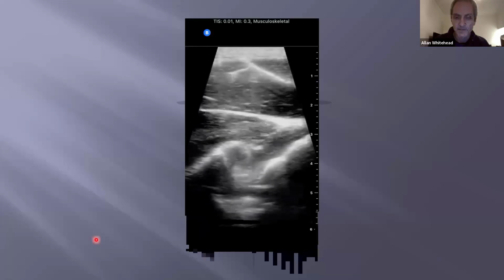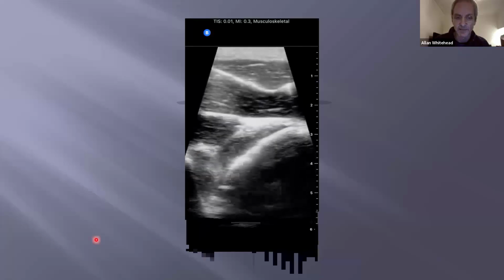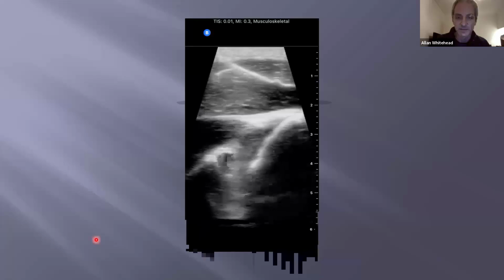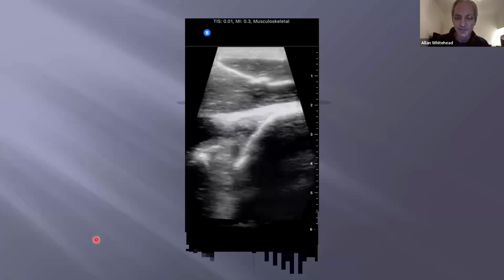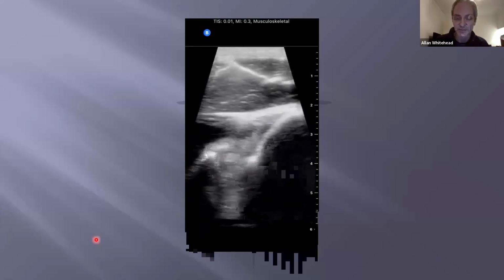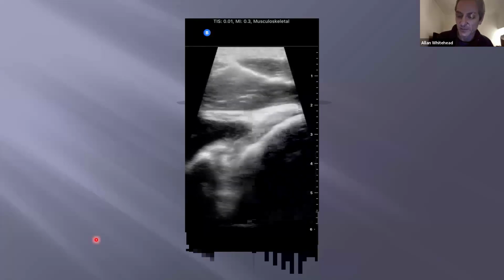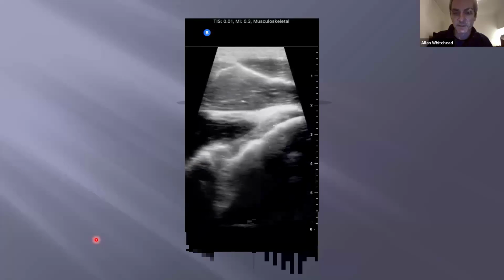Here we go. We started moving the upper limb, rotating it, abducting it. It's just neat how you can see everything in motion in real time. You don't get to do that a lot of the time with textbook anatomy or any static imaging like MRI, CT or X-ray. So I thought that looks pretty nifty.